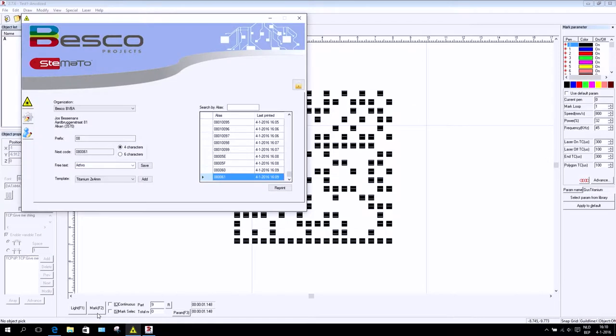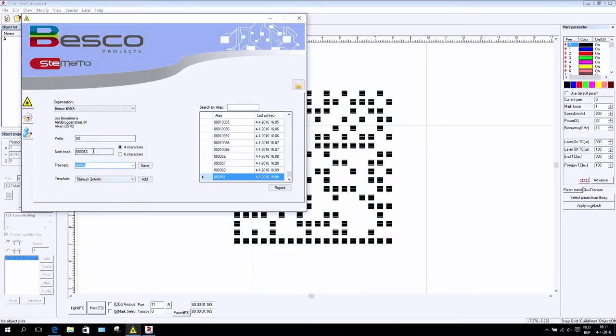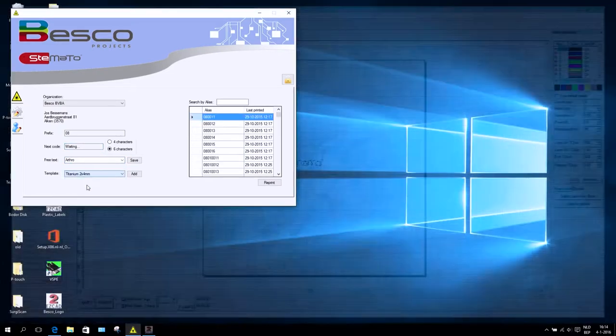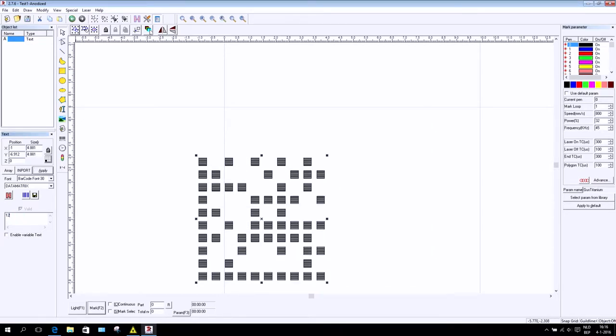The Besko Laser Management Software automatically creates and manages the unique codes and additional text you will use for marking. Your hospital identification, together with a 4 or 6 digit hexadecimal code, allows you to laser all your instruments with data matrix codes ranging from 1x3mm to 4x4mm.